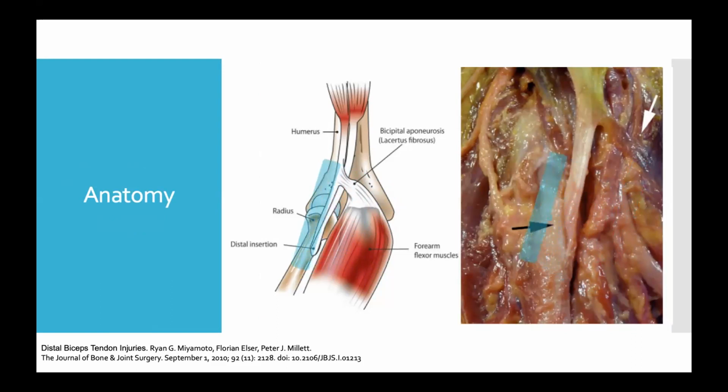When we're looking for the distal bicep, we want to start medially with the probe parallel to what we would expect the radius to be. We want to glide back and forth, glide towards the radius, and angle our probe just slightly. In the next image, we look for the brachial artery, and that gives us a very good acoustic window to evaluate the biceps tendon just inferior to that, just deep to that.